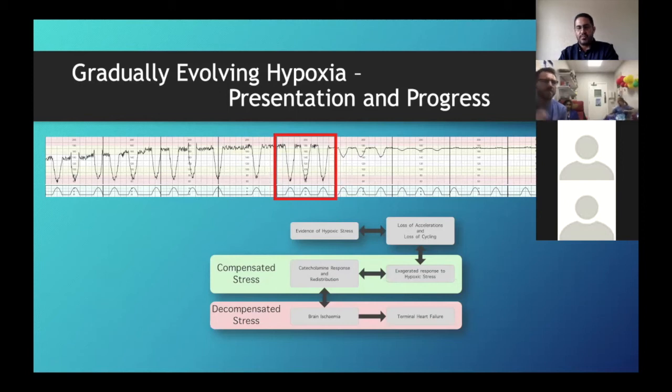Yeah. But if we manage the CTG well, then actually we're never going to prove that STAN is an effective intervention, because we're trying to prevent the STAN alarming in the first place. Yeah, I'm not trying to make it alarm. You're not going to convince me to make it alarm, Adam. No, me neither. I'm not trying that. But I agree. Susanna loves to say, it doesn't look like she's there now, but she loves to say trust STAN. But actually the key thing is to be able to manage it so that you don't get a STAN event, right? Which is why what I'm saying is that you're trying to prevent it all the way.